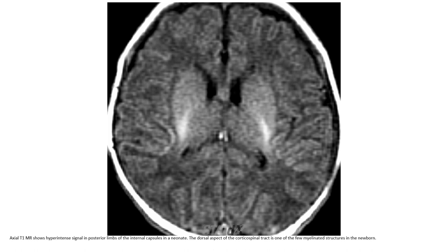T1 image shows a hyperintense signal in the posterior limb of the internal capsule in a neonate. The dorsal aspect of the corticospinal tract is one of the first myelinating structures in the newborn.